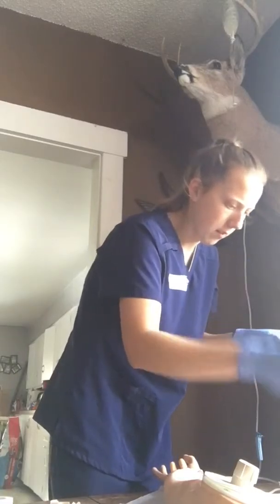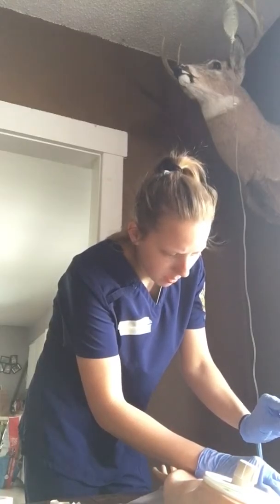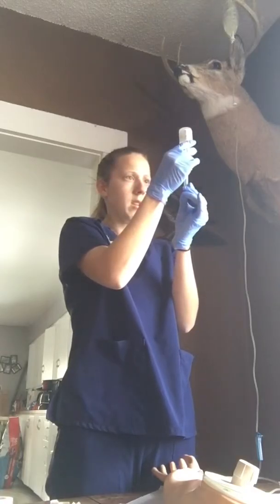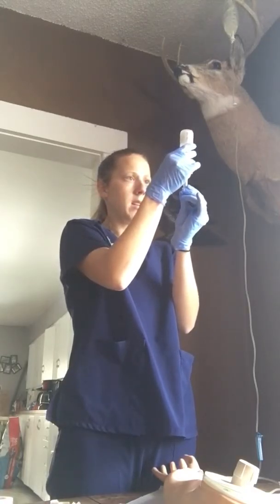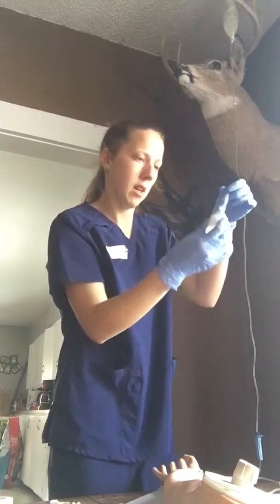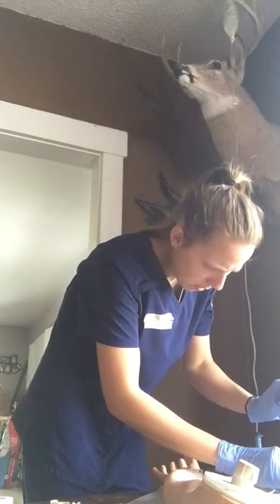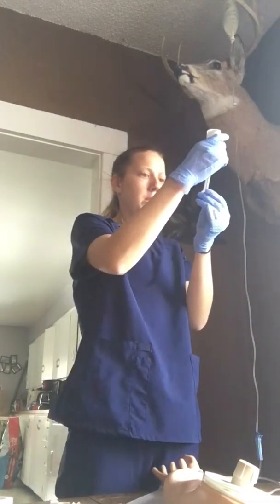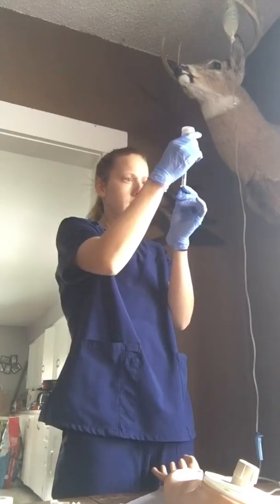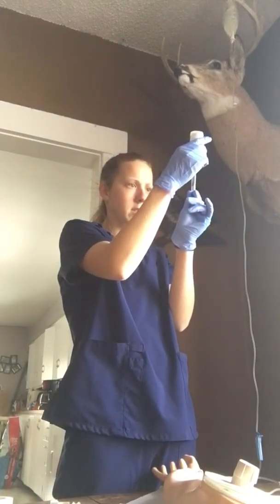I'm going to pull back one milliliter of Dilaudid. Then we're going to dilute it with two milliliters of normal saline, so we'll have a total of three milliliters.